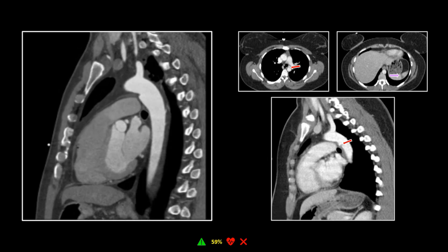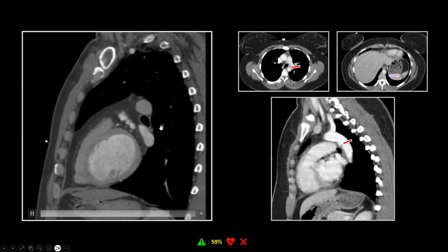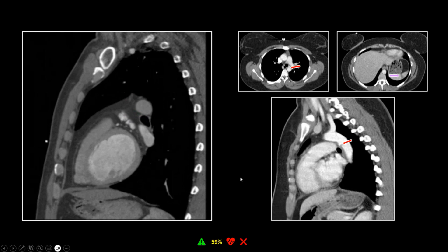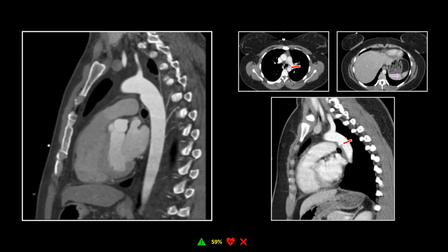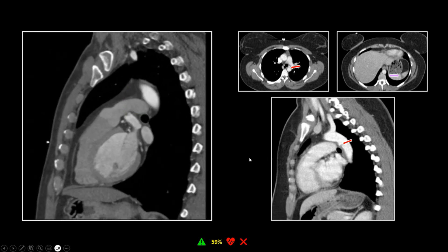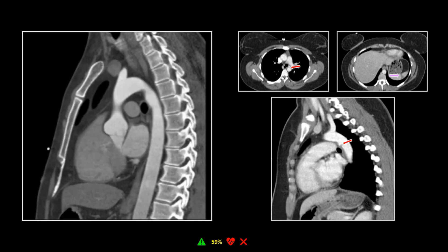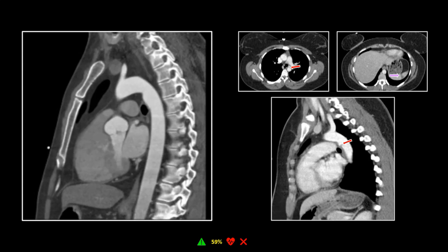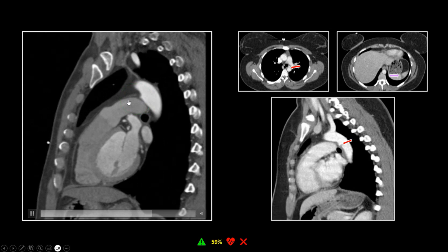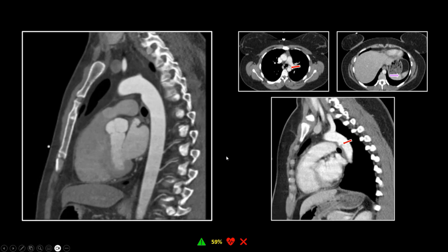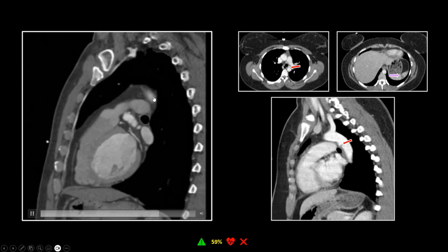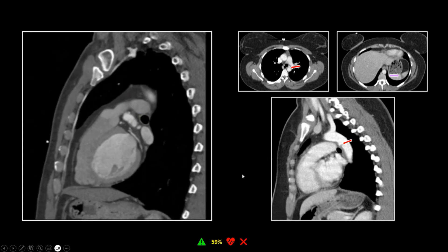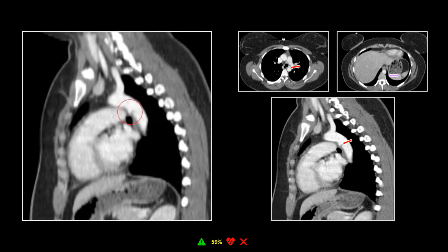Here is a PDA for comparison. A ductus diverticulum would be the broader-based dilation. If there is a little residual portion of a ductus, it's going to be more horizontally oriented and more forward on the aortic arch, because a ductus arteriosus attaches to the base of the left main pulmonary artery — so obviously it has to be more horizontally oriented and farther anterior. Look at that little jet of contrast from the arterial-pressure aorta into the left PA, going retrograde to the flow of blood in the pulmonary artery.